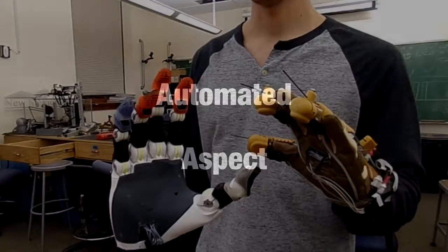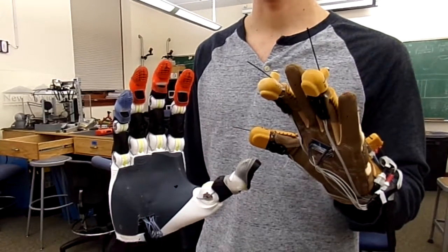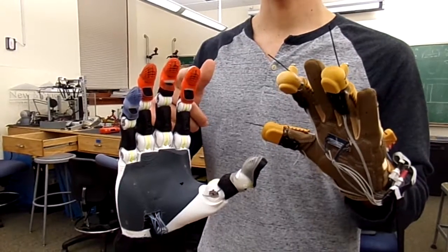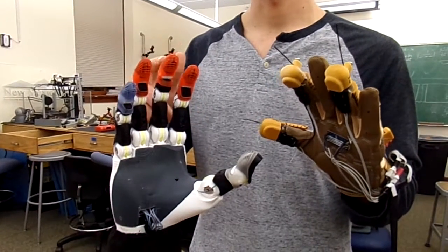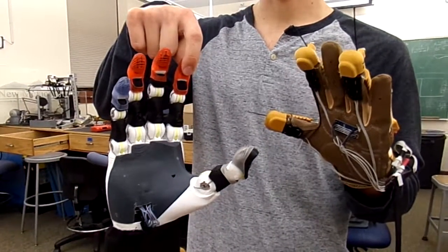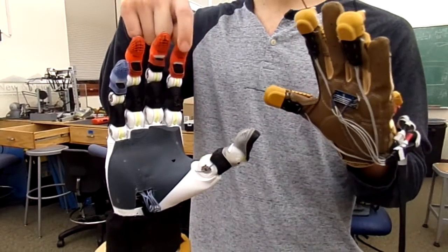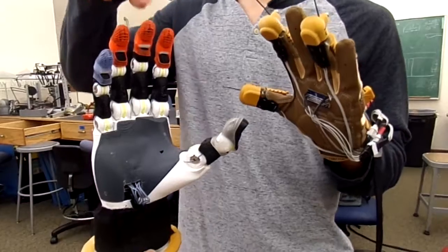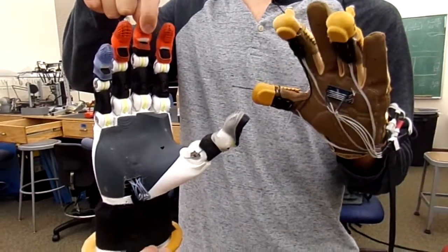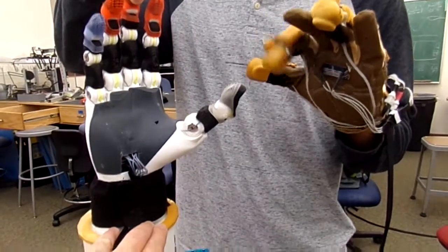This is a demonstration of the autonomous feature in our hand, where we automatically stop the closure of our fingers when we come into contact with an object. This feature is not implemented on the index finger right now, but it is implemented on the middle finger for demonstration purposes. So as you can see, when the index finger is in contact with my finger, it will continue to try to close the hand when I move my finger. However, when the middle finger is in contact with my finger, now the hand will not attempt to close, as it knows that it is in contact with my finger.